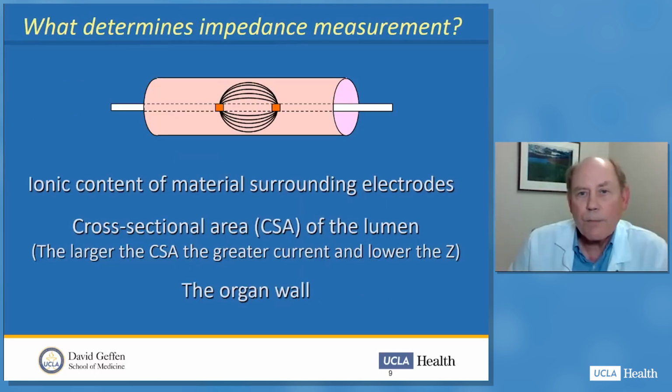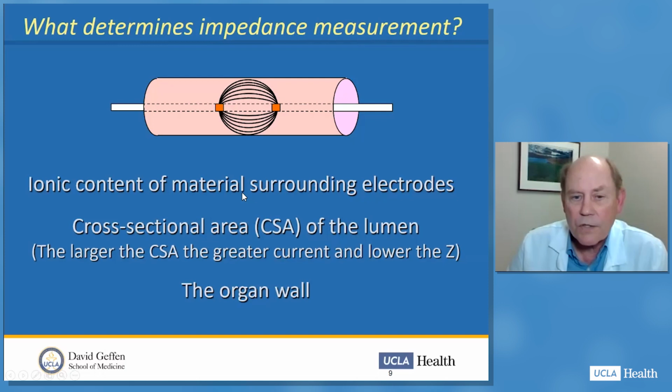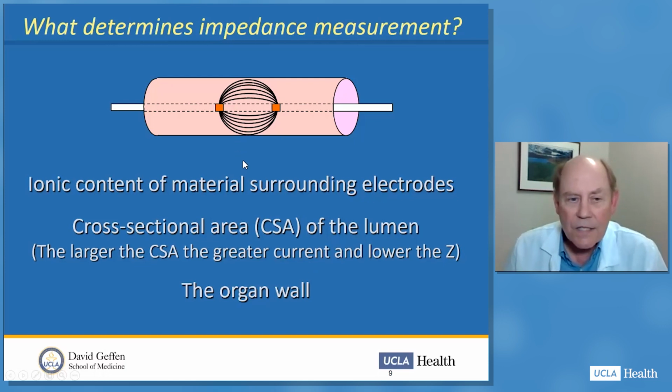So what determines the impedance measurement? It's three things: the ionic content of the material surrounding the electrodes, which in this case, with refluxed or swallowed materials, varies; the cross-sectional area of the lumen. The larger the cross-sectional area of the lumen, the greater the current and the lower the impedance. And then finally, part of that impedance measurement comes from the esophageal wall. So this is not a quantitative test for two reasons. There's variability in the ionic content of the bolus, and we are measuring impedance not only of the bolus, but the esophageal wall.